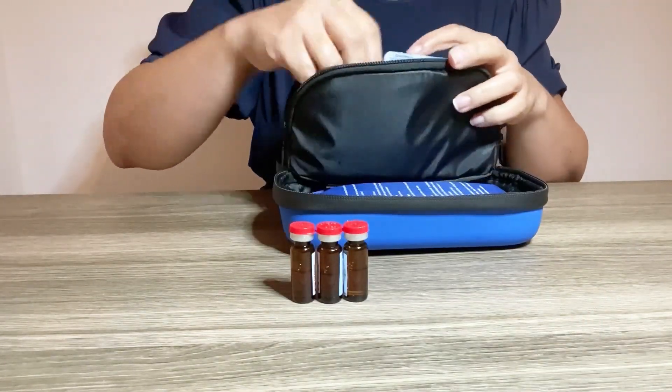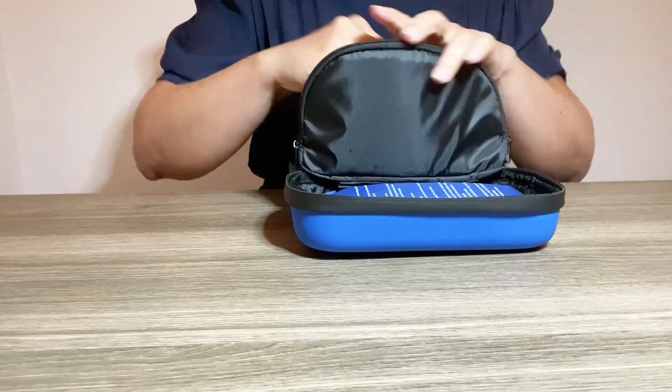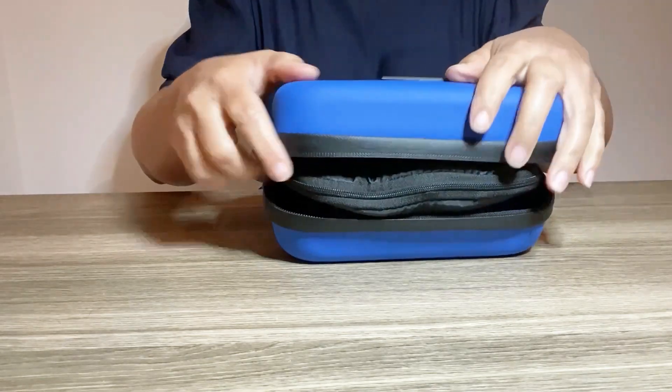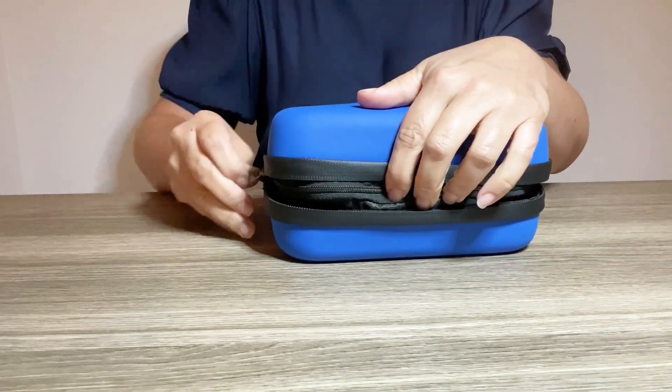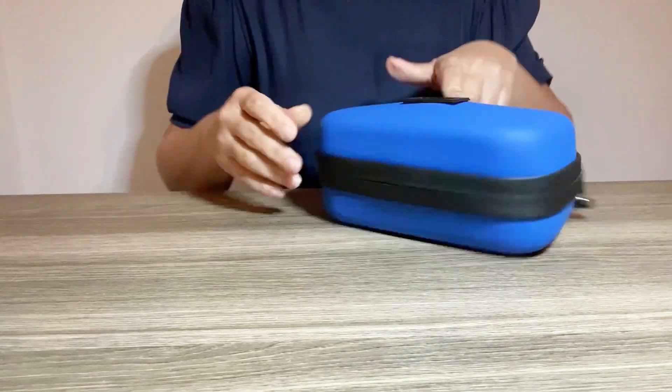This case offers a spacious interior that can hold quite a bit of medical supplies all at once. Now that we have everything packed in, we're going to close the case and use the built-in thermometer to periodically check the internal temperature and ensure it stays within the recommended range.